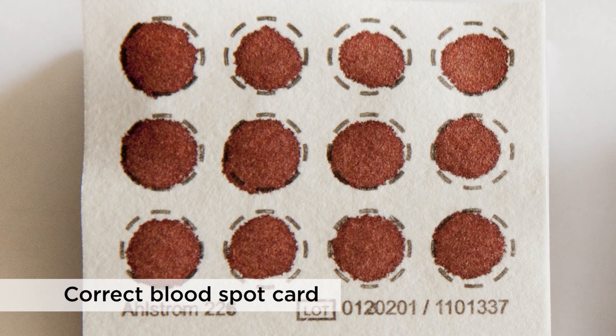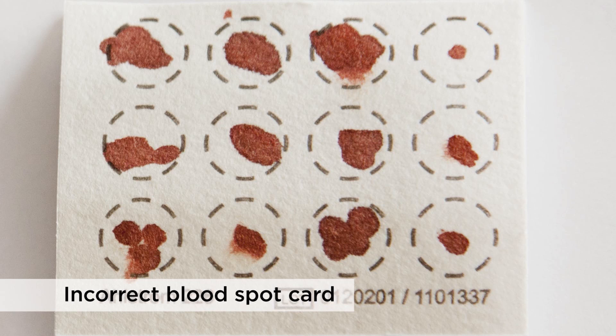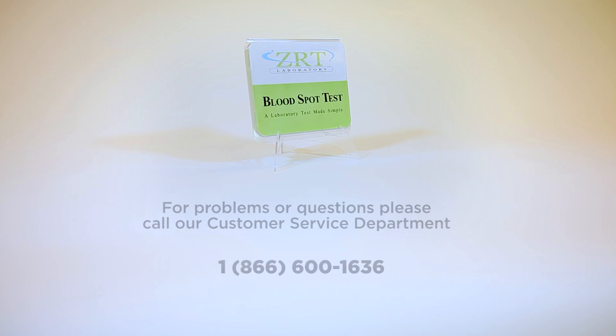Here's a quick look at a blood spot card done correctly, and here's a look at a sample not done correctly. If you have any problems in your collection, please watch this video again or call our customer service department at 1-866-600-1636.